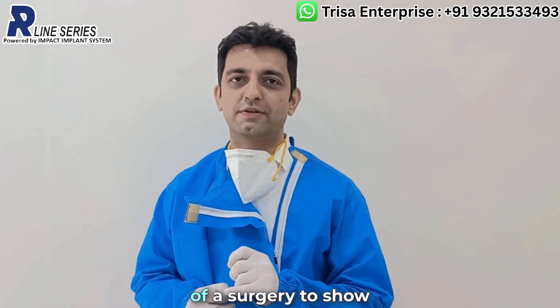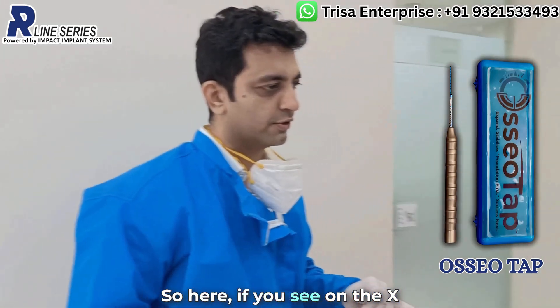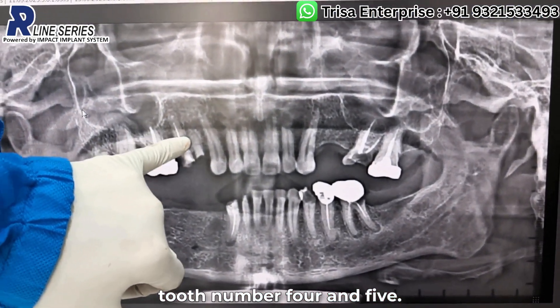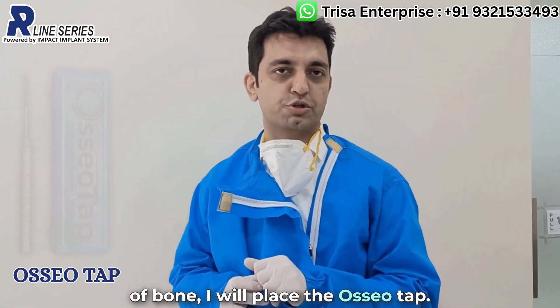I am recording this video in the middle of a surgery to show the benefits of the Osseo tap. Here, as you see on the x-ray, we have extracted tooth number 4 and 5. Now, if there is a dilemma in terms of the quality of bone form, I will place the Osseo tap.